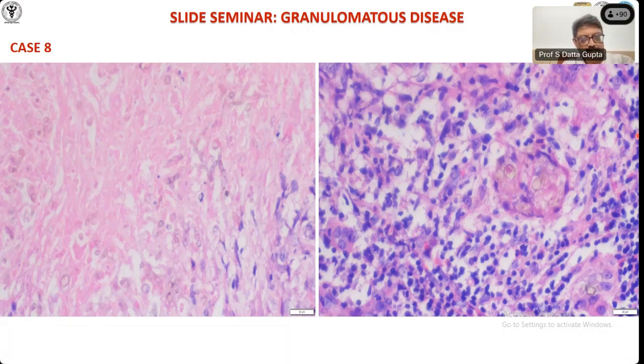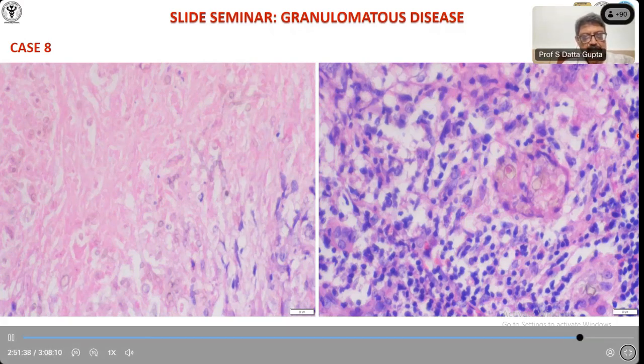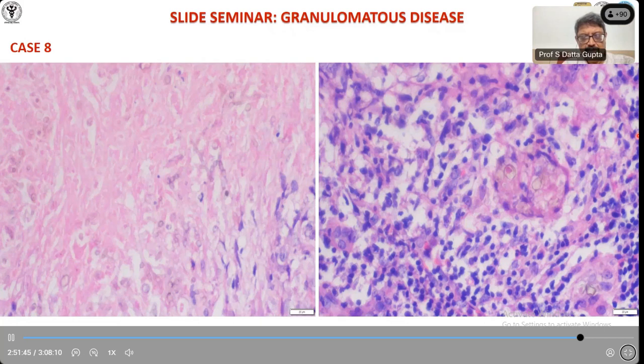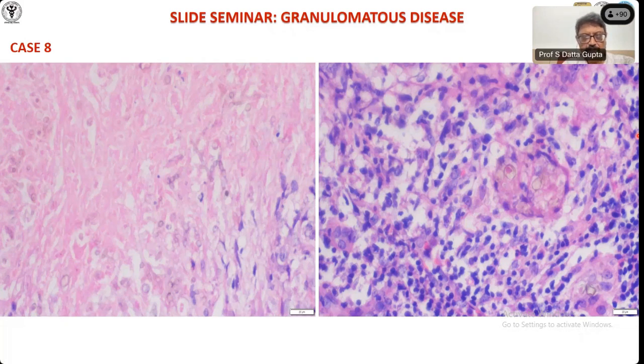Yeah, Rashmi. In which form are they, whether yeast form or hyphal form? Correct. You have to first tell whether they are yeast-like, rounded, or hyphal form. Suppose they are yeast-like, what will you see?